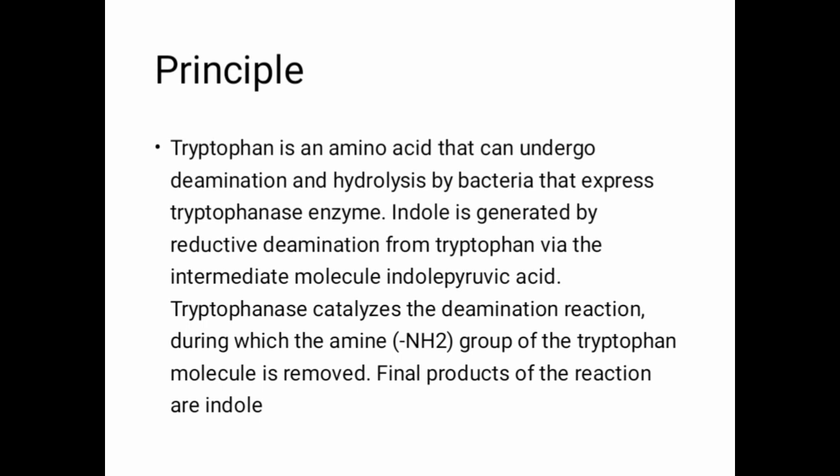So how do bacteria produce indole? Bacteria contain the enzyme tryptophanase. It catalyzes deamination, in which the amine group is removed from the tryptophan amino acid, and at last the final product that remains is indole.